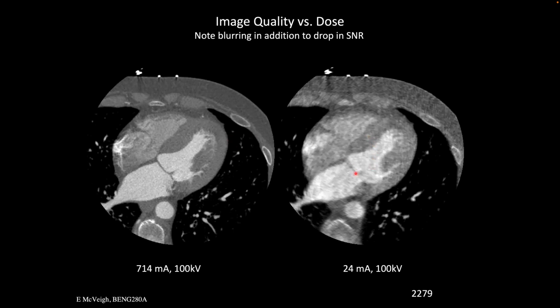So if you wanted to know, does this person have a heart that is the right size? Is the muscle contracting in the right motion? What is the volume of blood in the left ventricle? All of those things you could measure from this data. If you wanted to ask the question, is this coronary vessel, which is the left anterior descending coronary vessel, open, right? And if it's open, you have this big bright signal here. We go over here and say, well, I have no idea, right? So this image just can't do that, right? It doesn't have the quality to do that.